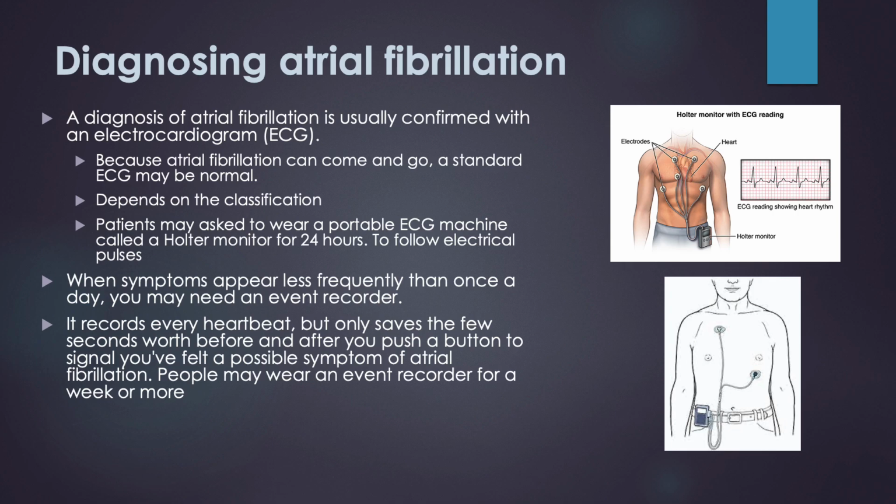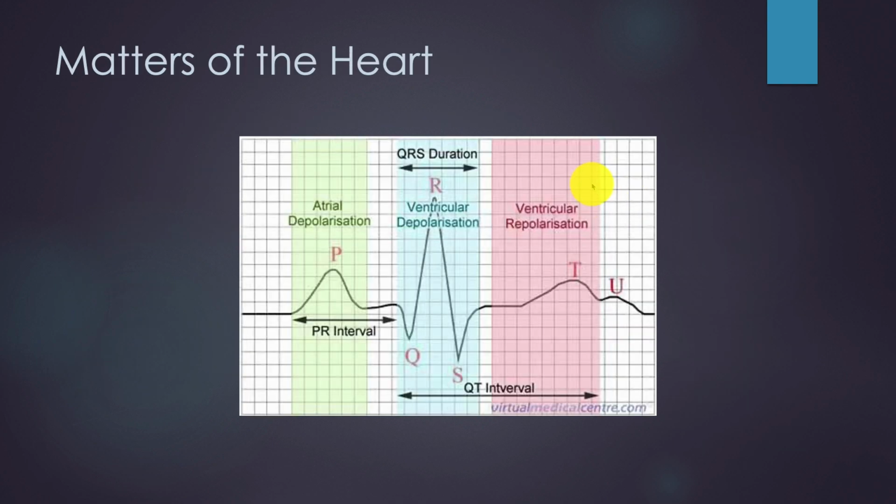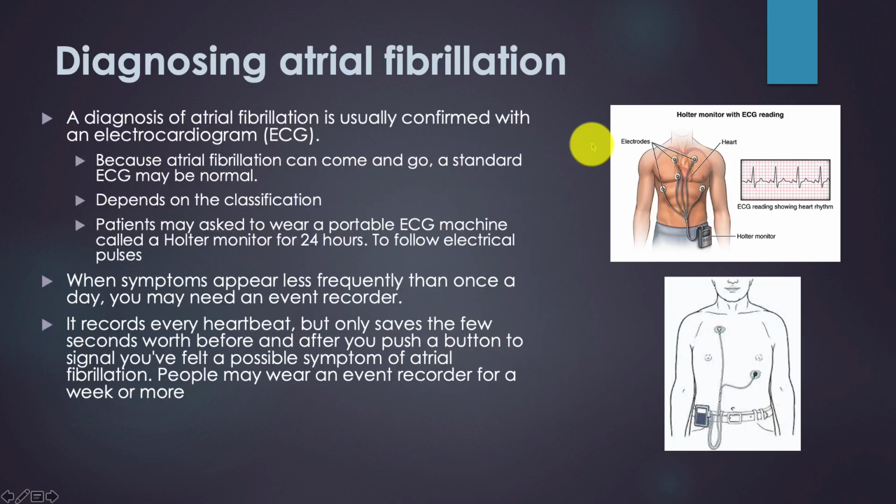One of the major tools for diagnosing AFib is the ECG or the EKG, and we're going to spend a bit of time talking about this today and going over some animations. When I asked you guys to watch the video last week, I was purposely vague because I wanted you just to get an idea of how this works, and I'm sure you already know what it is.